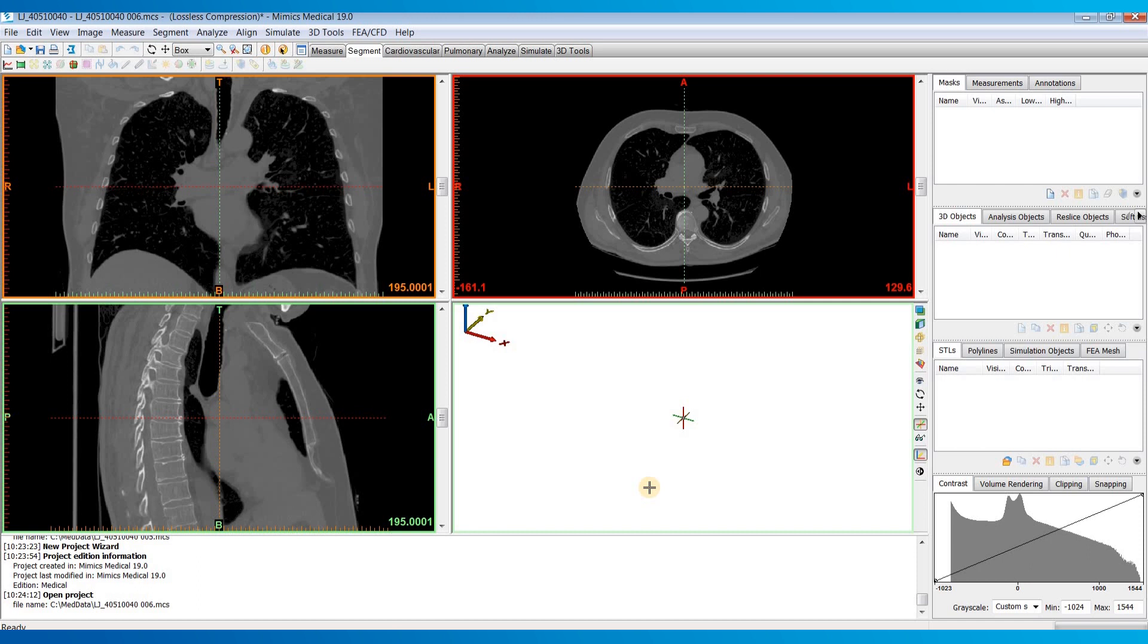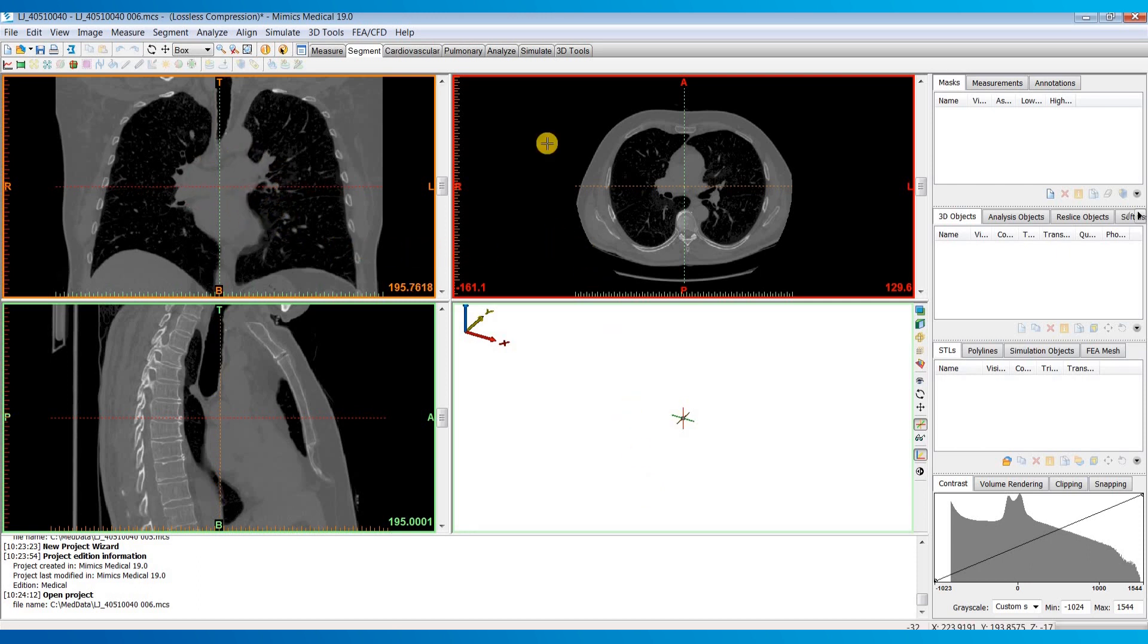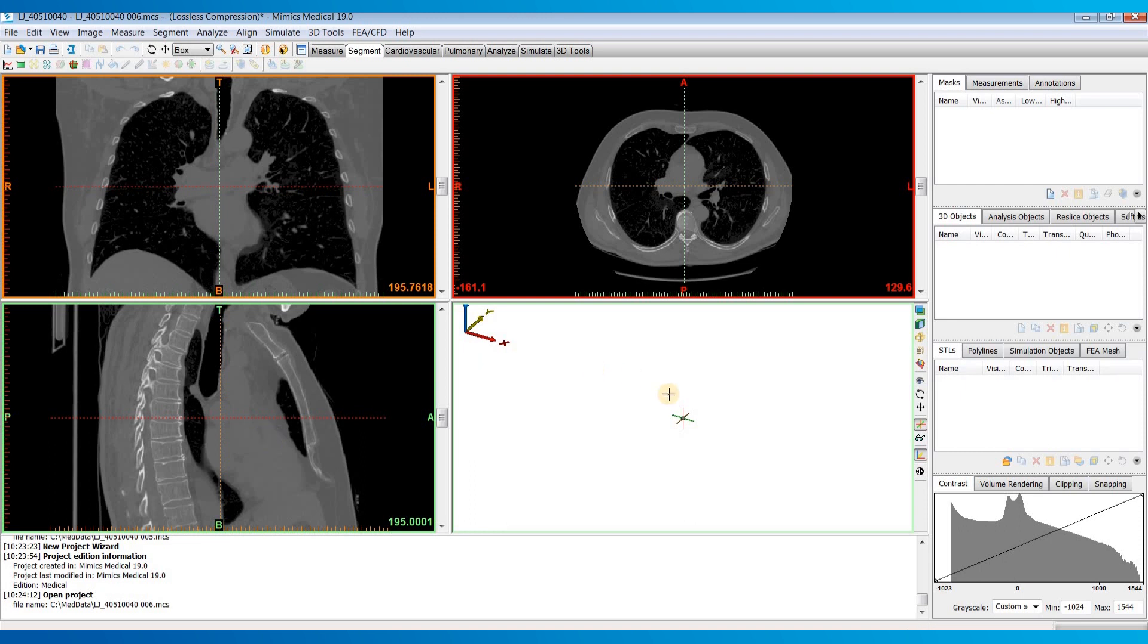You can see here we have our three planar views of the images. On the top left is our coronal plane. On the top right is our axial plane, and our bottom left is the sagittal plane. The bottom right is our 3D window which any 3D models that we create will populate in there.